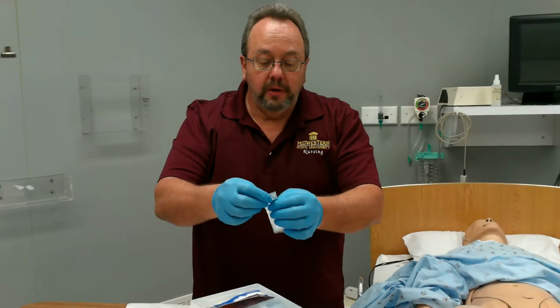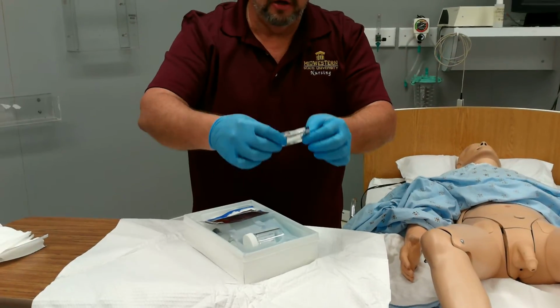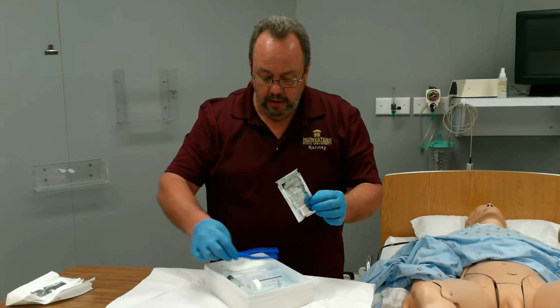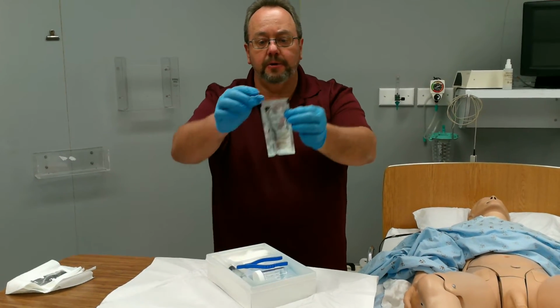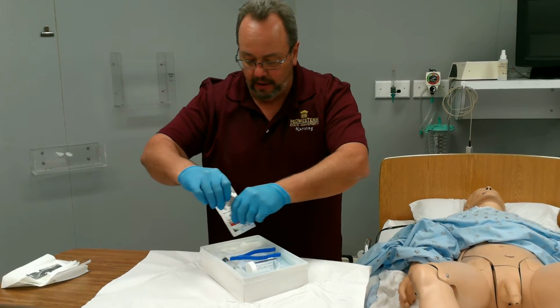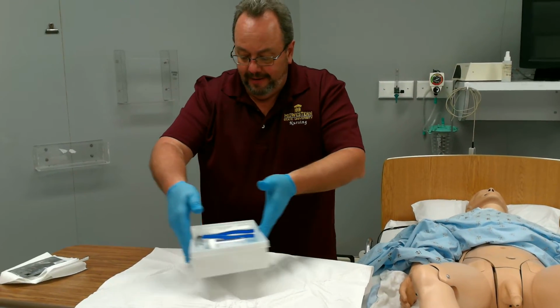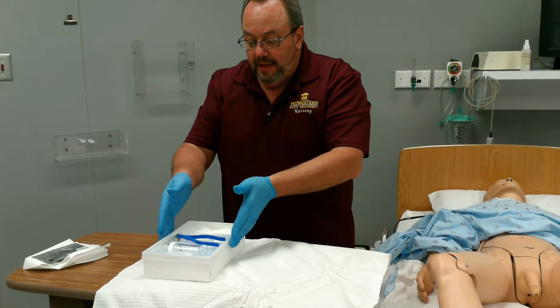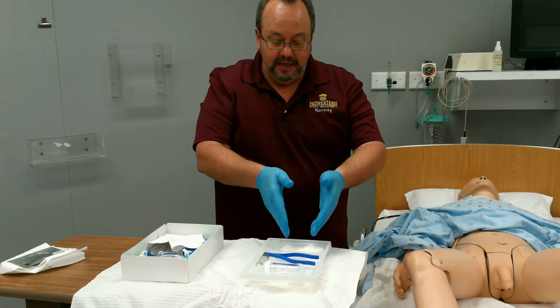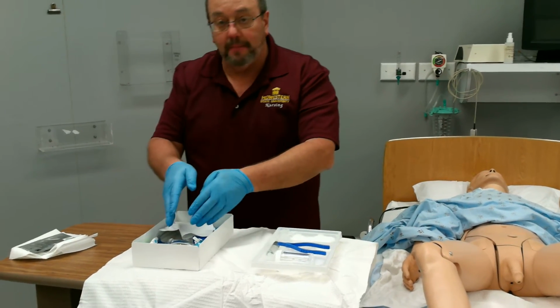With the lube, you will simulate that you're going to open this, put a glob right here, so that you can come back to it later. You're going to simulate too that you're going to open this betadine soap and soak your gauze or your cotton balls, and then put this to the side. Now take this, put it over here to one side, then take the tray off the top, put it to this side here, the closest to the patient, because this has your gauze so that you can work right near your patient with it. Now I have to set up my catheter.